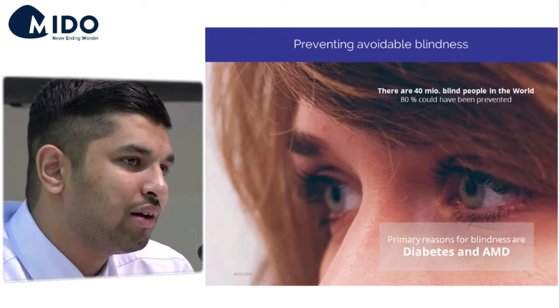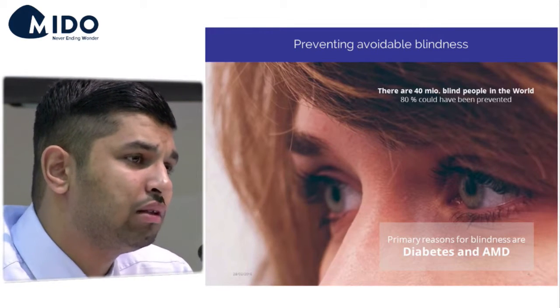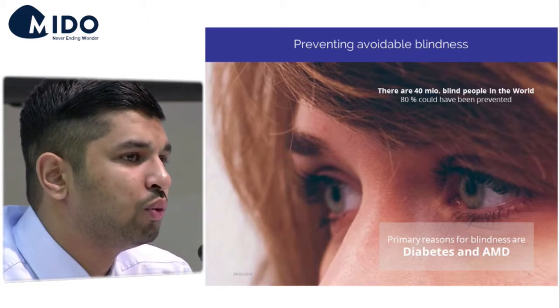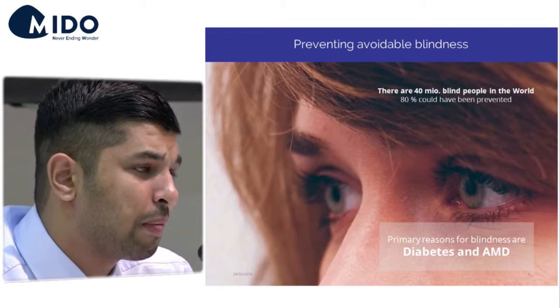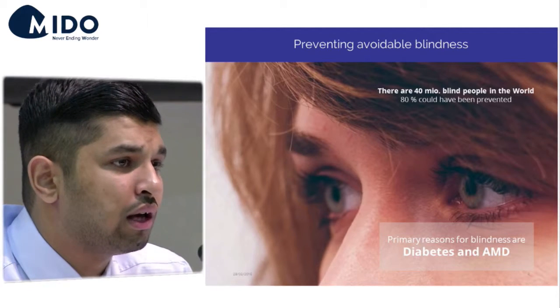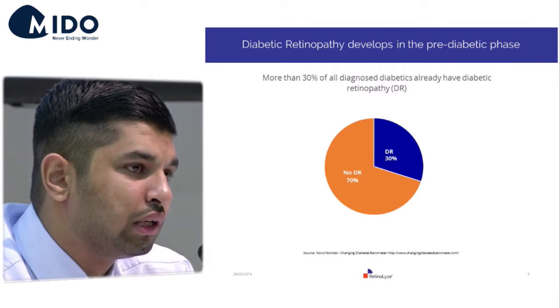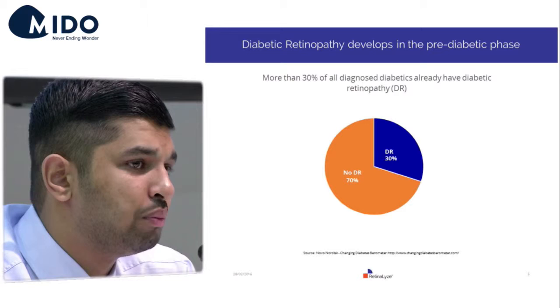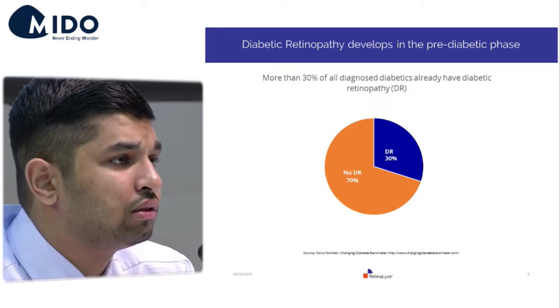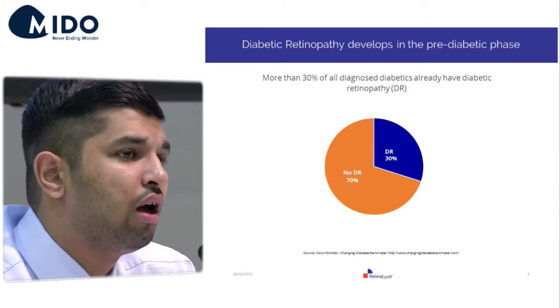Just to show you why we need to do this, there are actually 40 million blind people in the world, and if we had made screening attempts like this, in a screening of the general public, we would have prevented about 80% of these. The primary reasons for this blindness in the Western world are actually diabetic retinopathy and AMD. About 30% to 50% of diagnosed diabetics will get diabetic retinopathy within their lifetime, which means there's a lot of people who need to be screened and a lot of people who need to go for annual screenings somewhere.